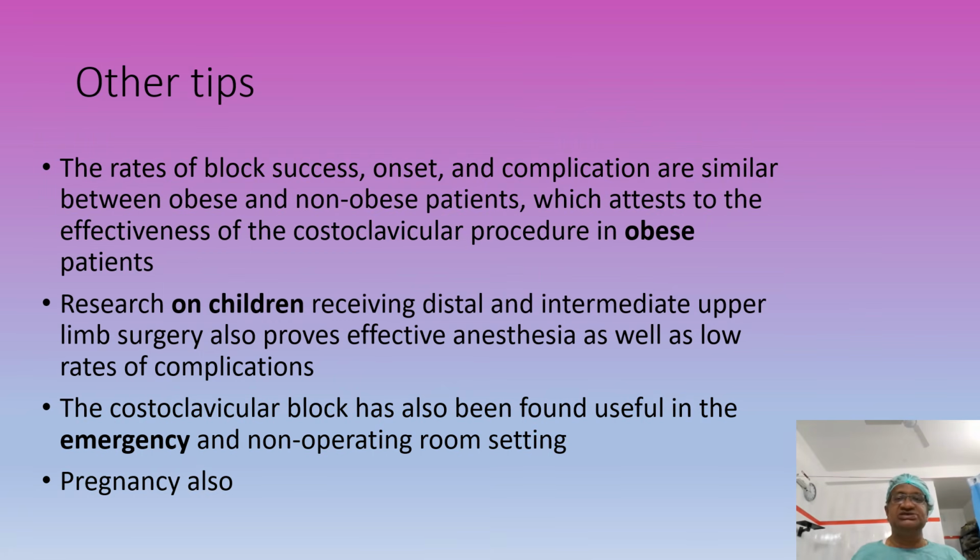The rate of success, onset, and complications are similar in obese and non-obese. So obese, okay. Children, okay. Emergency, okay. Non-operating room, okay. Pregnancy, okay. So these are all the tips of the costoclavicular approach to the brachial plexus.